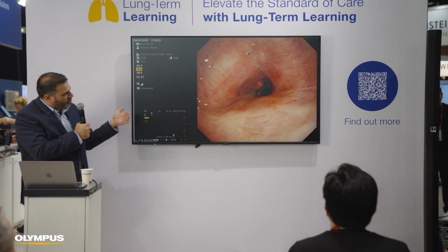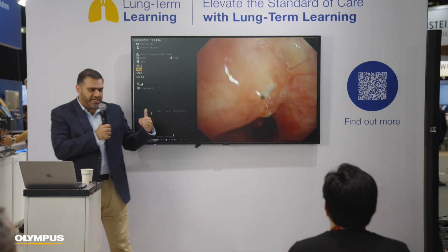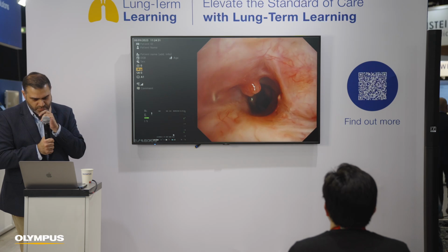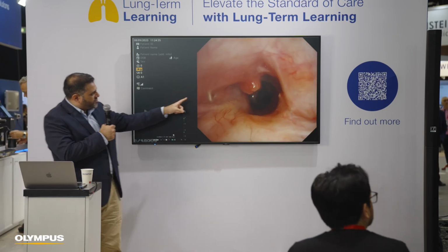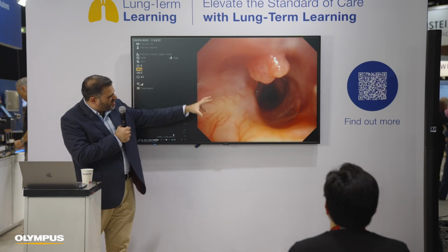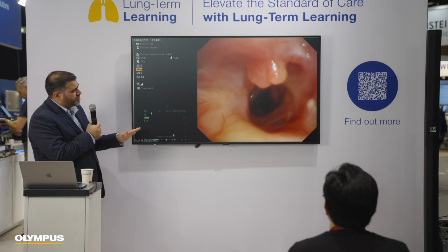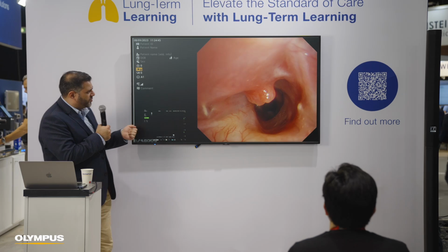He has multiple problems: he has granulation tissue, and then he has multi-level stenoses as we go down his trachea. And so he very frequently requires a procedure just to remove the granulation tissue because it usually grows enough to block the airway. On this occasion, it wasn't actually as bad as I thought it would be.